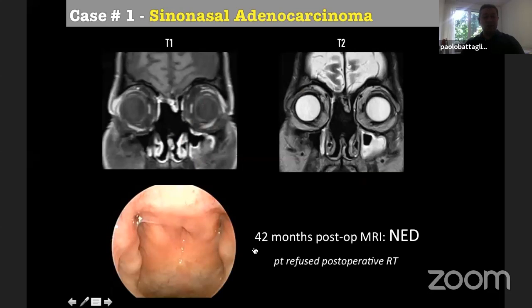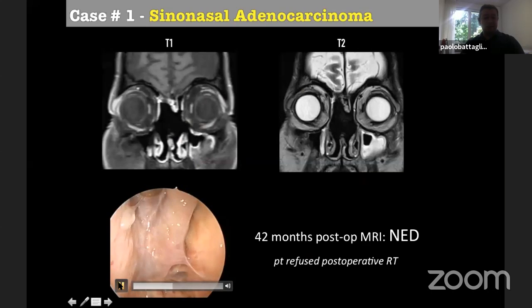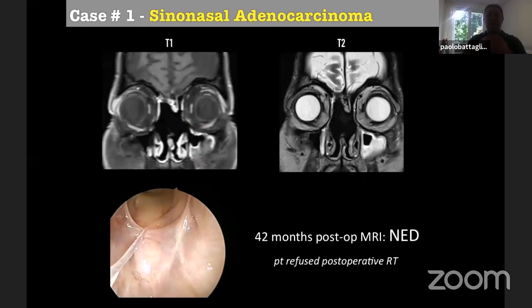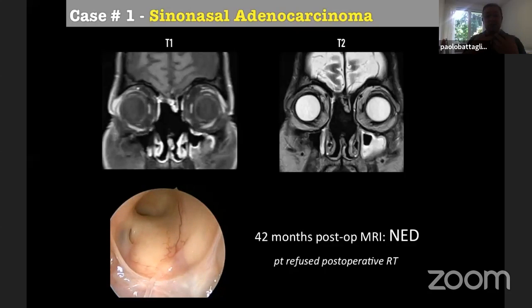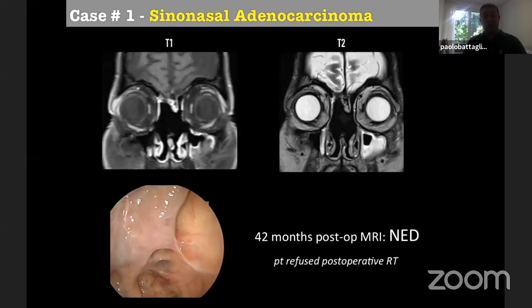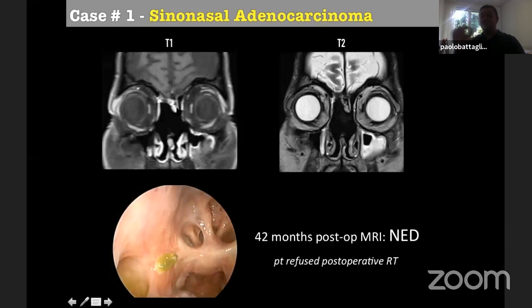42 months later, this is the postoperative control. Let's see here, sphenoid, and let's see. It's marvelous, the healing. Before this kind of flap, we used mainly fascia. There were a lot of crusts for many months after surgery. In this case, after a month, it seems that he did not have skull base reconstruction, because it's a perfect healing. It's vascularized, and as you can see, it's preserved the contralateral olfactory cleft.